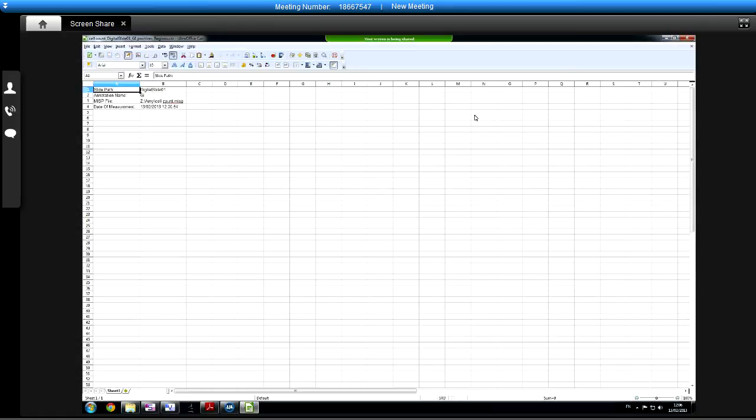Right. So this regions one here is the one that gives you the individual data about each object, and there's nothing in it because we didn't measure it. We told it not to put anything in there. But then we ticked the box to say generate file. So it's just generated a file with nothing in it. Okay. So this is the other one. So this is the area one.